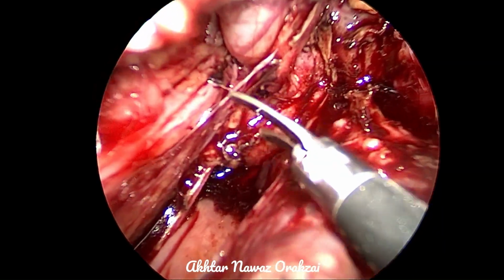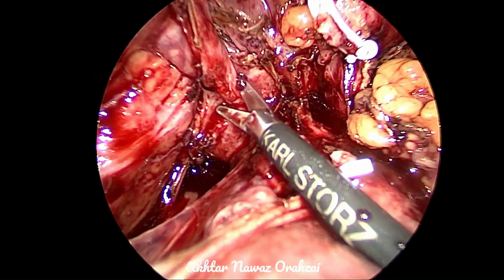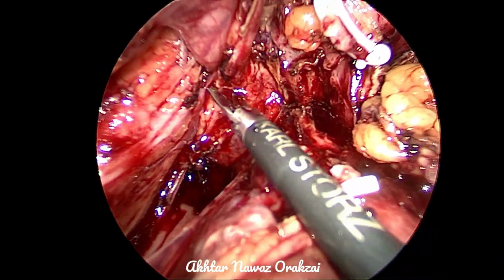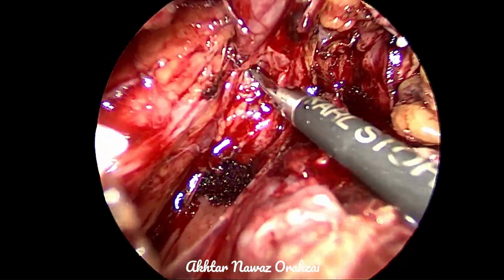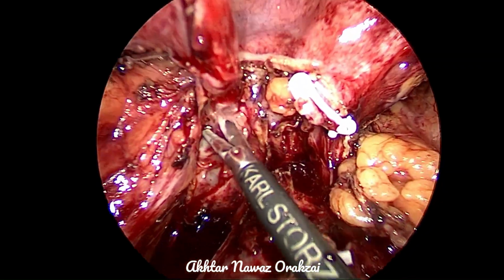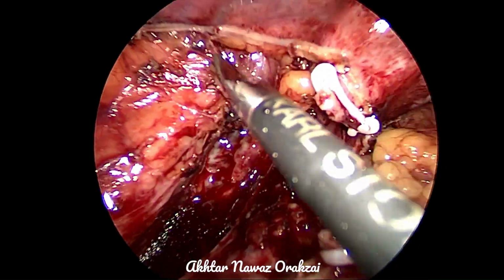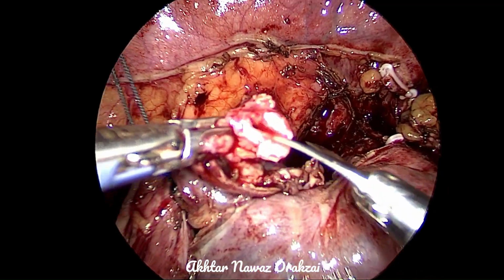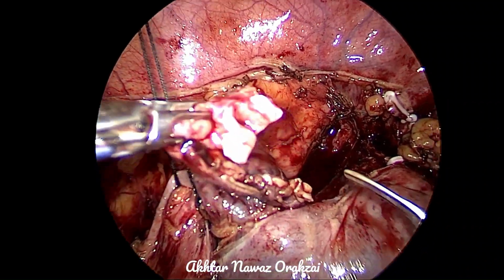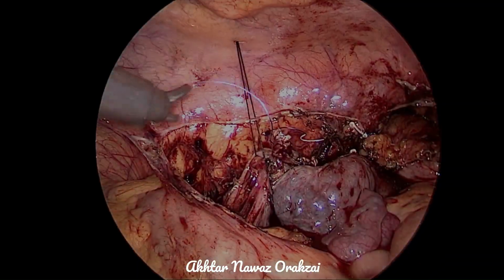Now we decided to cut the ureter at the site of obstruction. Here we are not using any diathermy or energy source, and a pure cut is made with the scissors. It is okay if it bleeds a little bit after cutting; if it is bleeding, we can coagulate that portion. It is not really important to clamp the distal stump of the ureter because it is already stenosed and obstructed. A little bit of spatulation on the posterior aspect of the ureter is made so that the anastomosis is wide.